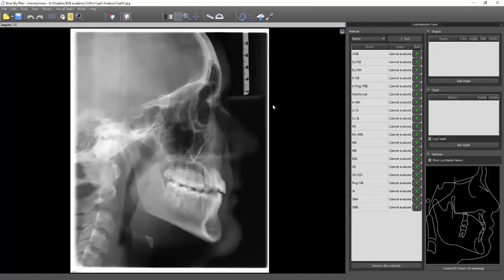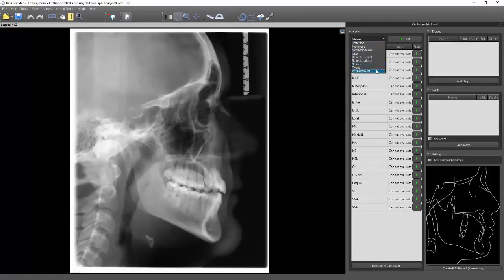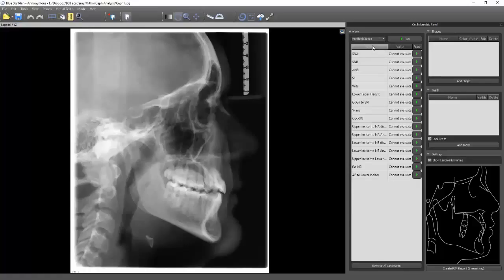Okay, so here's my ceph. We can come over to this drop-down right here, and there are various different analyses you can run. The one we're going to use right now is the Modified Steiner. This is what is taught in the Garrity Orthodontic course, and it's the one I'm most familiar with. We're just going to hit Run, and if you watch over here, it's going to tell you what you're trying to mark.